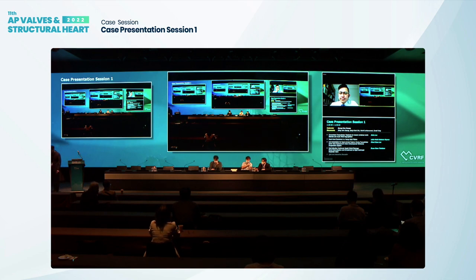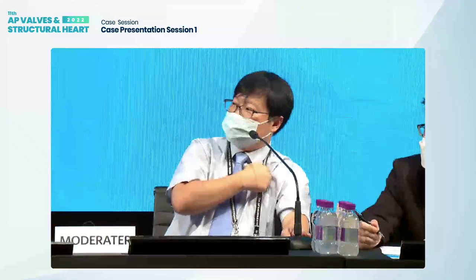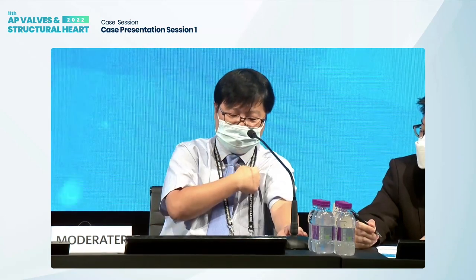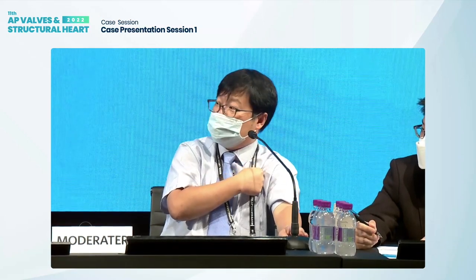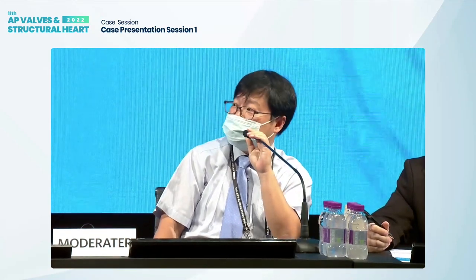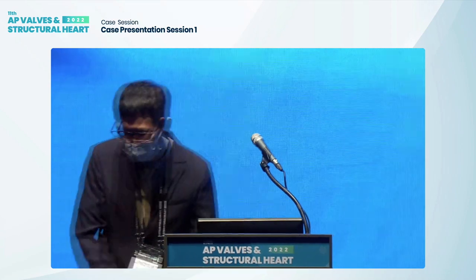I have one comment because you took the surgery for putting the ECMO in the trans axillary artery, right? Yeah, trans arterial graft. But in our instance, we do direct transcatheter axillary puncture with no surgery. So if you can do that procedure, then we can put the ECMO to femur. So I think it's another option too. A very good option, but our center has no transcatheter subclavian. Okay, great case. Thank you.